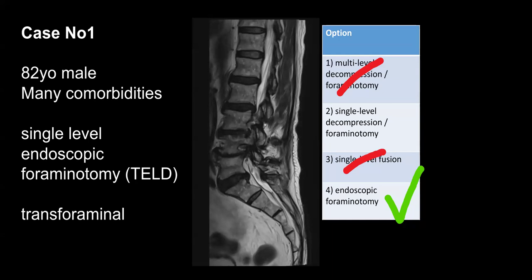I would not have been able to present a case like this 5 years ago. So this is a pretty new technique for me in my hands. I still take much too long for these stenosis to decompress. I wish I could do this in 60 or 75 minutes, but I'm still over 2 hours.